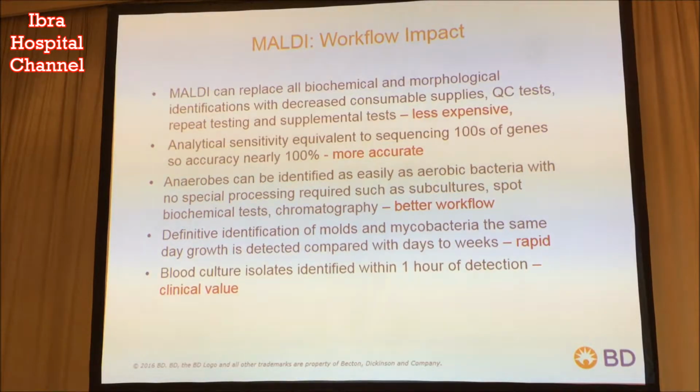What I can tell you is that MALDI-TOF will replace all of the biochemical and morphologic identification tests that you perform. And this means that you're going to have less consumables, less quality control tests, certainly less repeat testing that you would get with biochemical tests, and less need to do supplementary testing, all of which is going to reduce the cost of doing organism identification.